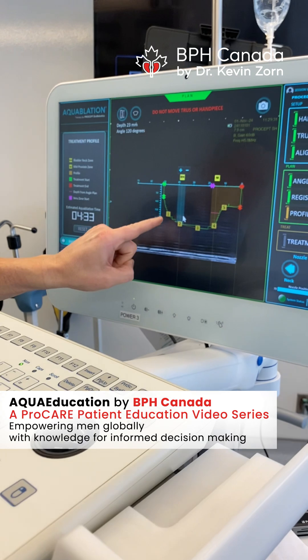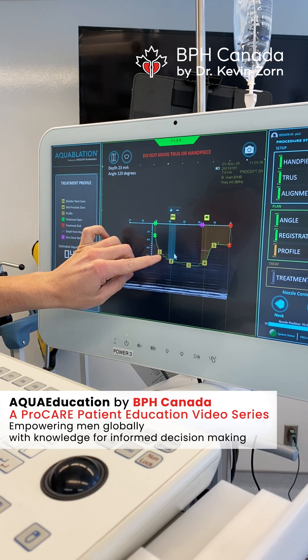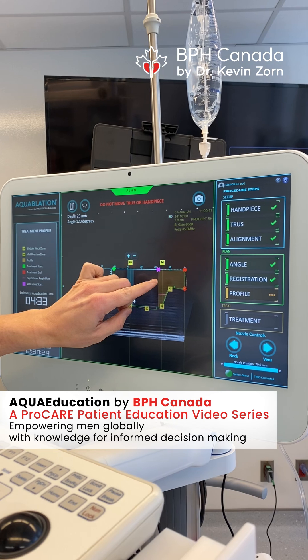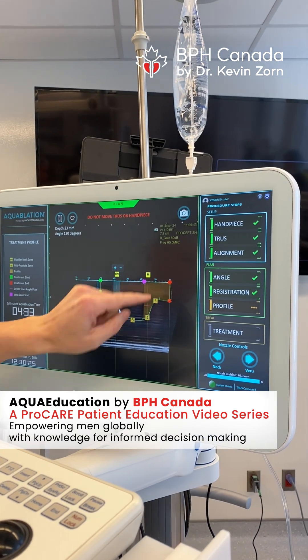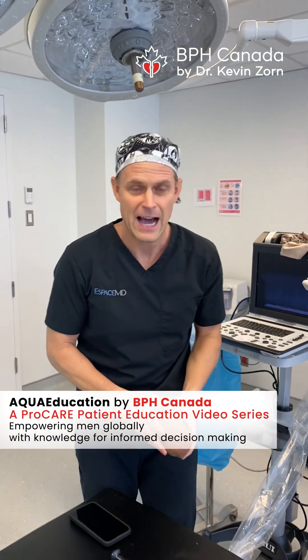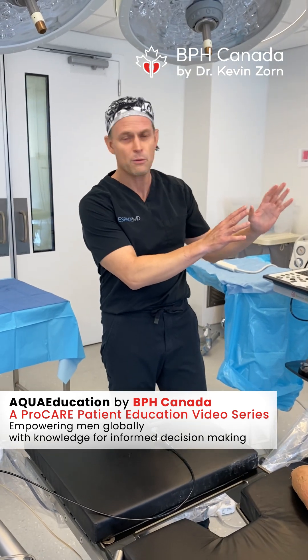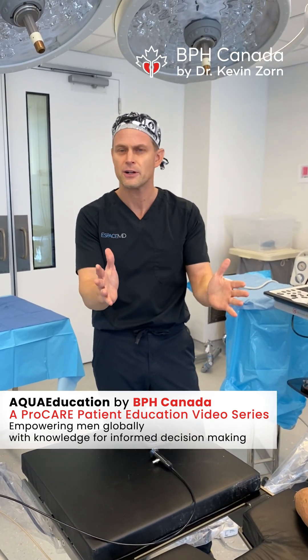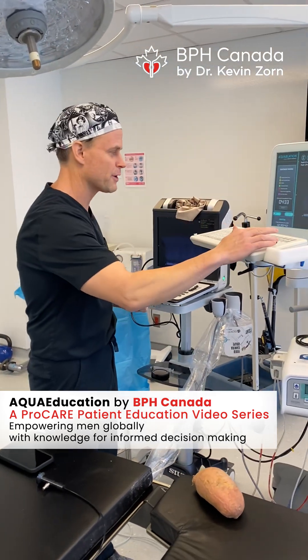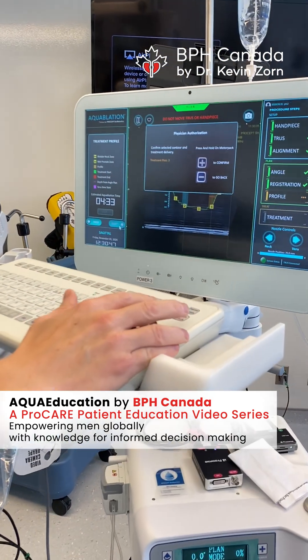I made kind of an awkward shape here, simulating this is our bladder. This is the beginning of the prostate with a tapered end toward the bladder — a cut, very linear. And then to bring it up into the butterfly zone and to make sort of an awkward shape to see — is this what we're going to get in a potato? It will be impressive how precise this treatment will be. Once we've designed out what we want to do, we're going to go ahead and get started using pure water, heat-free treatment with laser precision. We've already mapped out how wide we want to treat, and like a windshield wiper, this will open up.